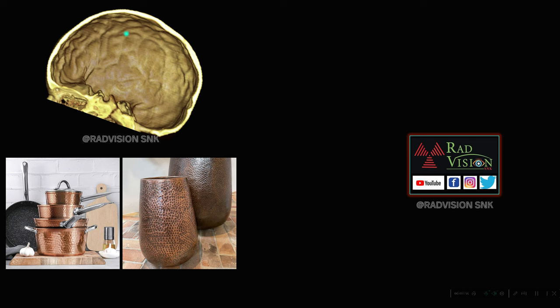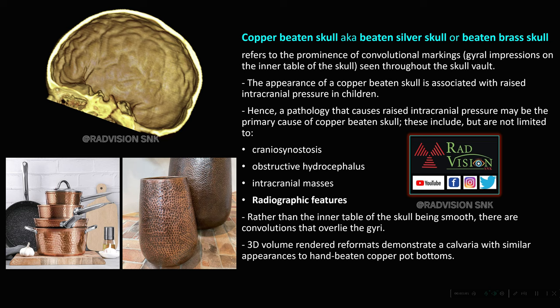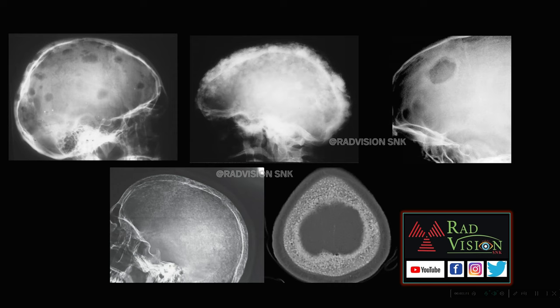This compression creates impressions on the inner surface of the skull, giving the copper beaten appearance — also called copper beaten skull, silver beaten skull, or beaten brass skull. It is classically seen in raised intracranial pressure in children and may occur in craniosynostosis, obstructive hydrocephalus, or intracranial masses. Always do 3D volume rendering to better demonstrate this appearance.